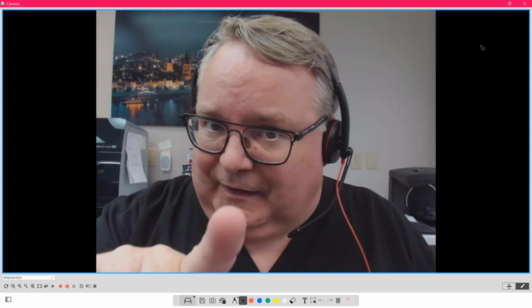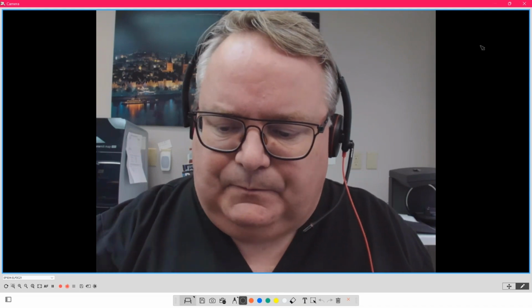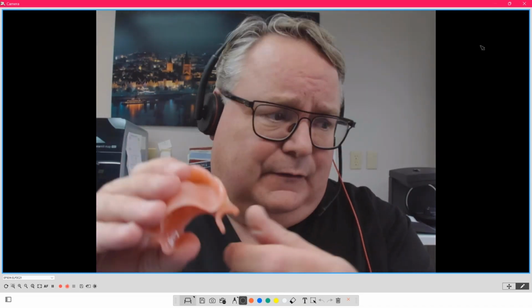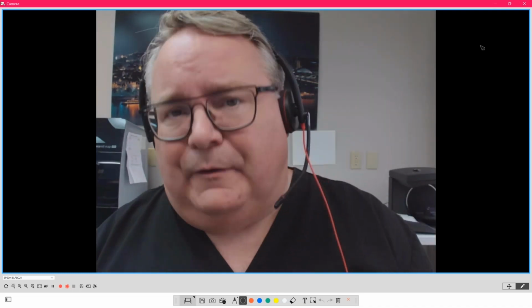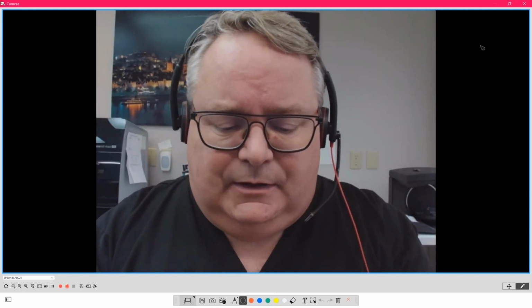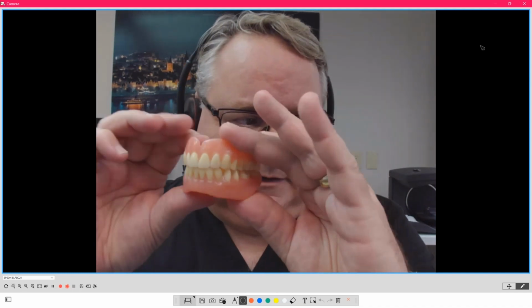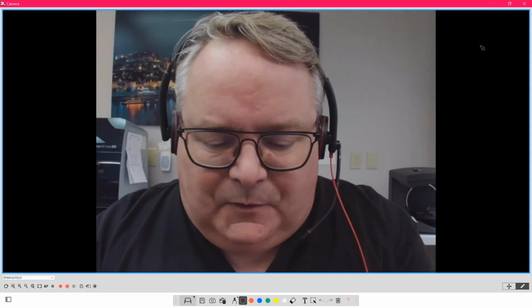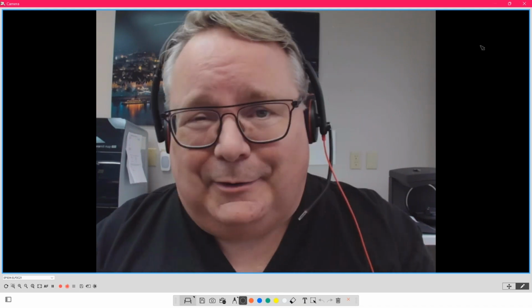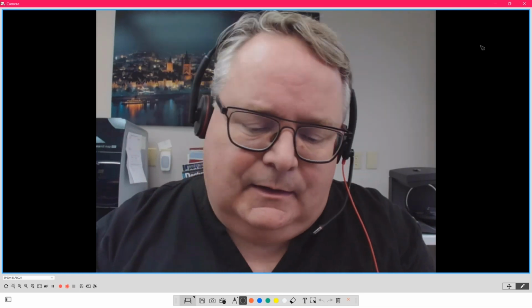So circling back to my earlier comment, what spawned my introduction and look to something different was I would build a denture, I would take impressions, final impressions, registration, open the vertical as required, set things up, working and balancing occlusion, put the dentures in, have the patient come back, and the patient would say, geez, Mark, the new teeth are looser than the old one, or geez, Mark, things are loose and the bottom still lifts. And you'd go, well, it's a bottom and it sits on less gum and you don't have any gum, and we use soft liners and this and this.